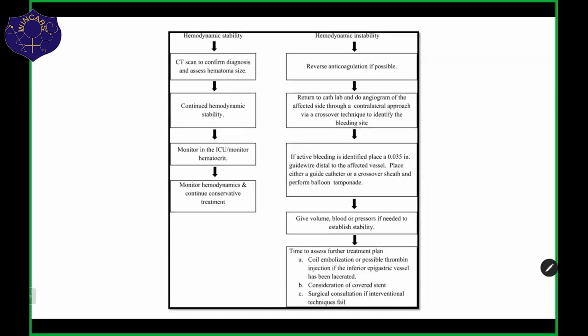Most of the time, if there's a posterior puncture, then it's very difficult to control. The best thing would be to take the patient up for angio and balloon seal it, and the rest of the procedures are given here. Coil plugging I have not done. We have seen procedures like wall stent being used or balloon sealing being done. For the one or two bad experiences I have had, I have managed them with balloon sealing.